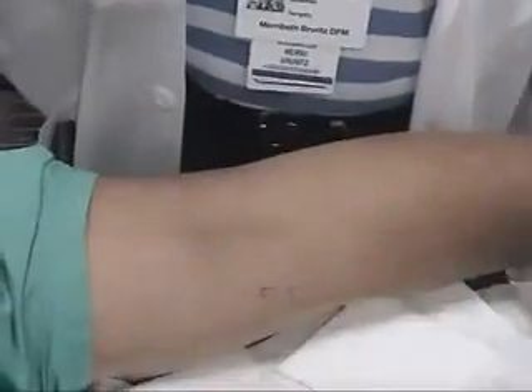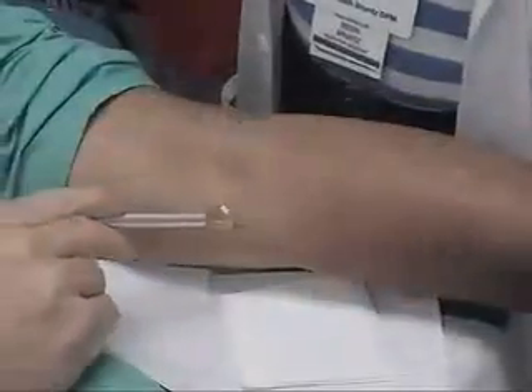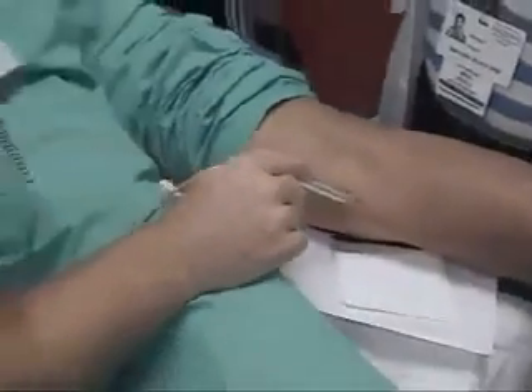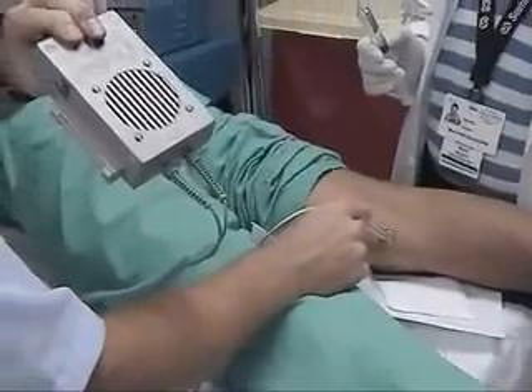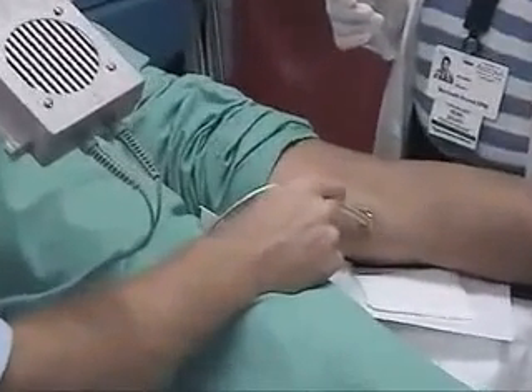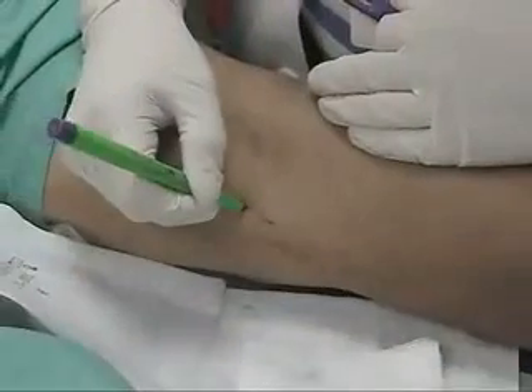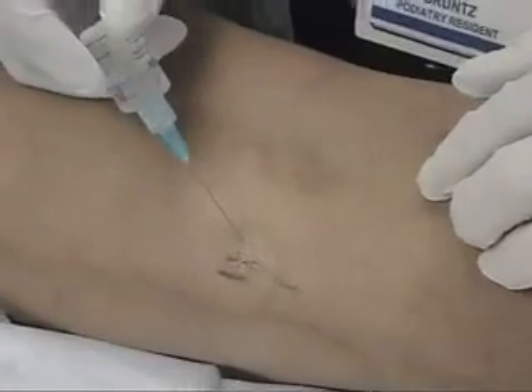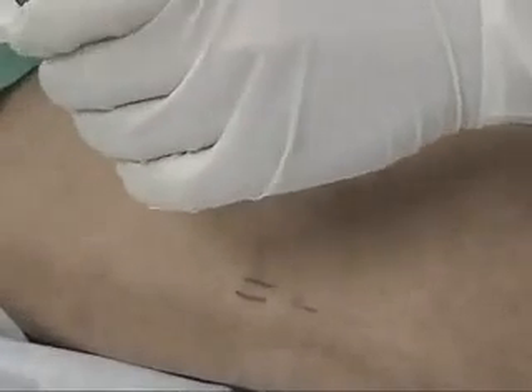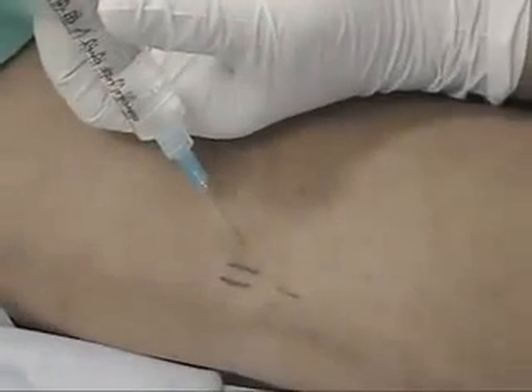Initially, the patient is placed prone on a procedure table. In the proximal medial aspect of the popliteal fossa, we palpate for the popliteal artery. This is done initially by palpation and subsequently with a Doppler probe. We then mark that area and subsequently instill our anesthesia just laterally to the popliteal artery.